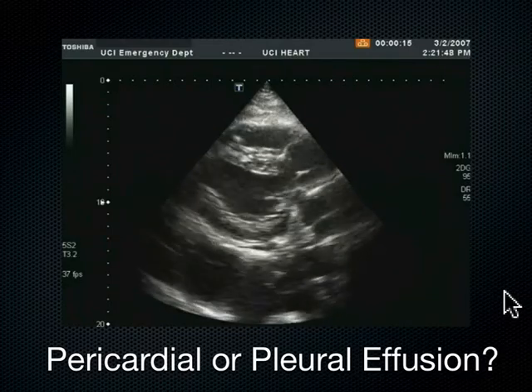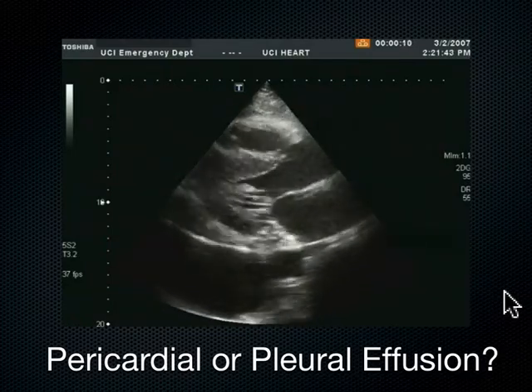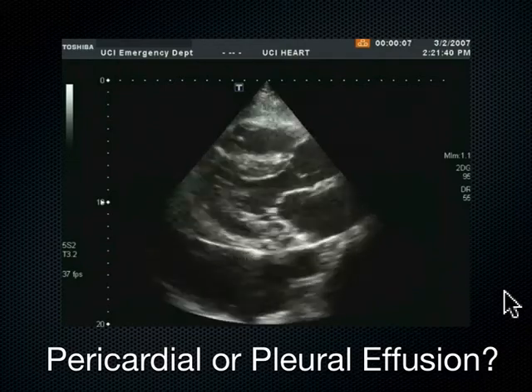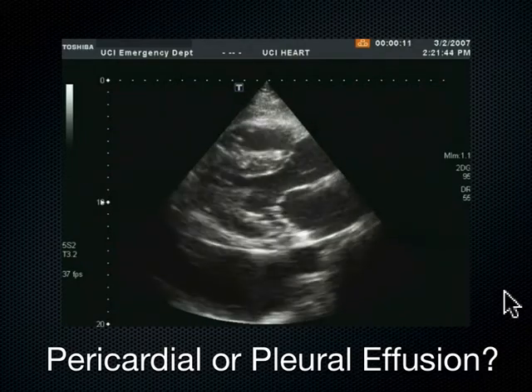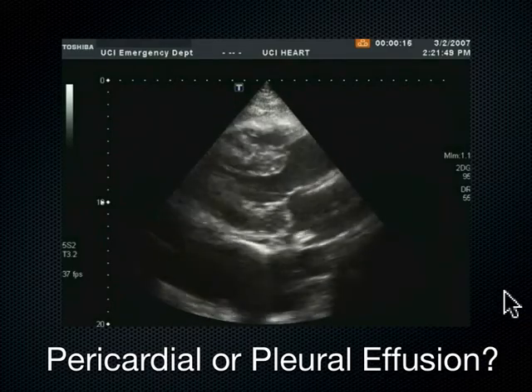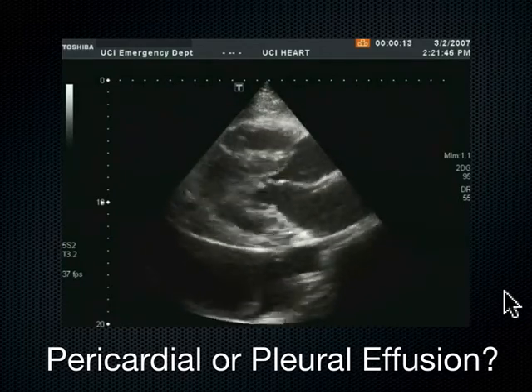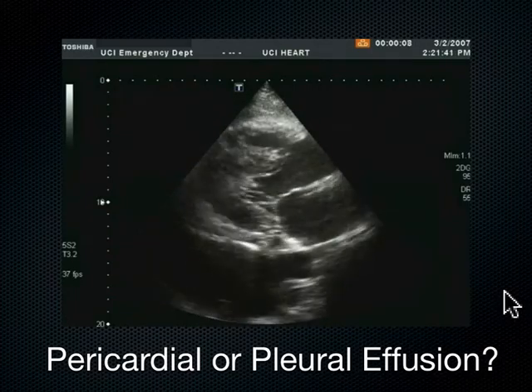Confusing. I agree. It looks just like a pericardial effusion. If it wasn't for that descending aorta, how do I normally diagnose a pleural effusion on the left? Simple. I go into my FAST exam window, looking at the spleen and the diaphragm. I look superior to the diaphragm, and if I don't see the mirror image artifact of the spleen up in the chest, if I see all this black stuff on top of the diaphragm, looking coronally, laterally with the P21 probe, then I know, with the same probe I'm using for this, that this confirms to me that this is pleural. I always do that.